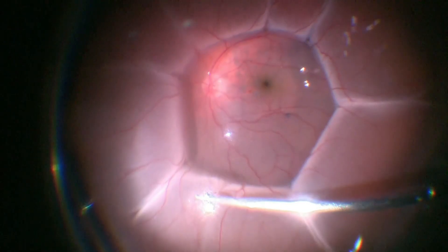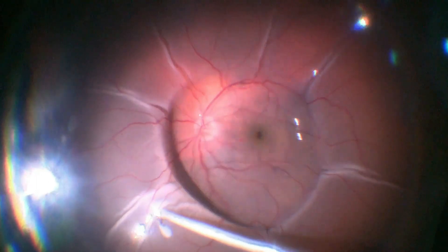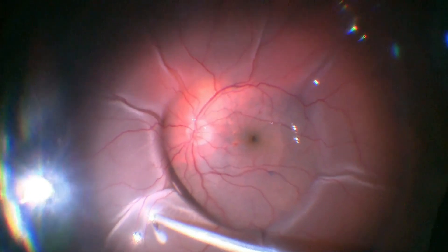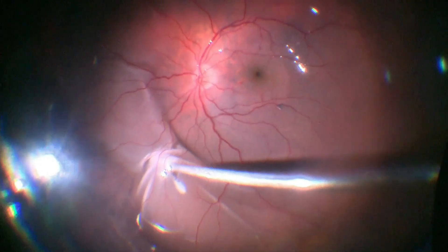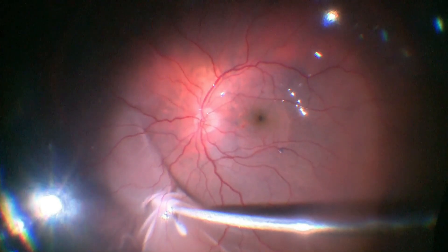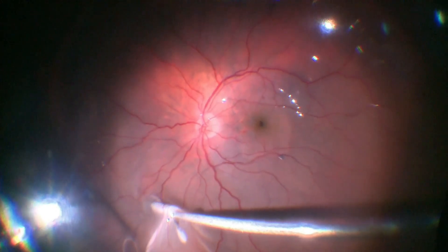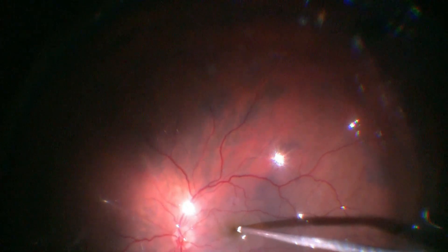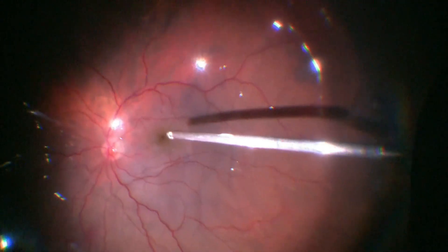Relaxing retinotomy was made and the retina was flattened out. Residual fluid was aspirated from the edges of the macular hole.